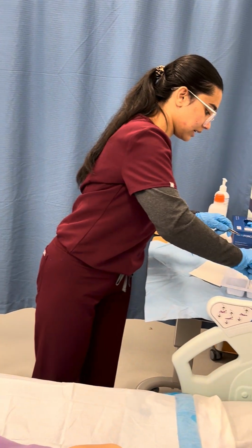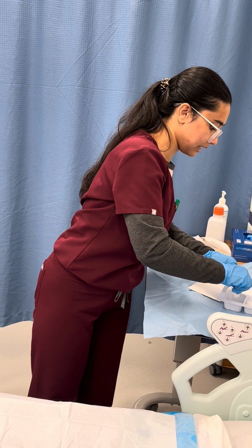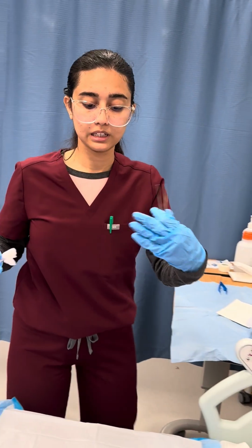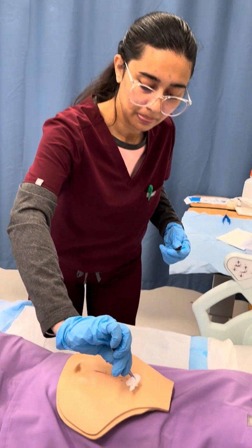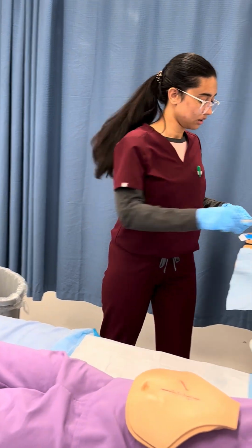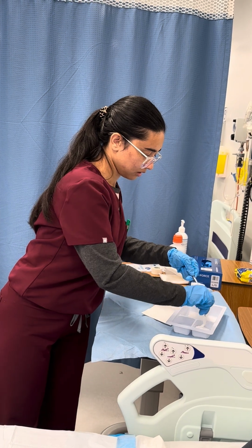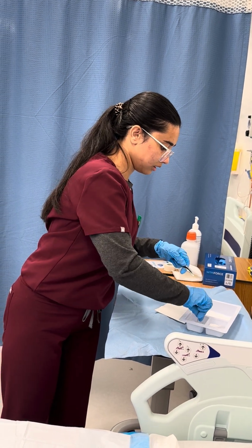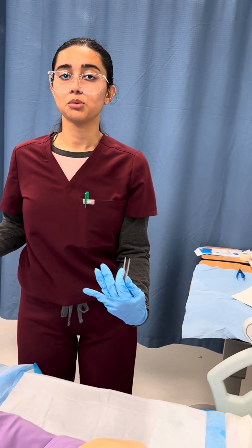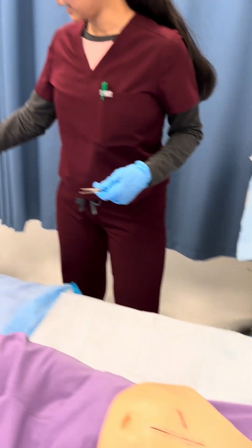I'm going to take another gauze piece, dipping it in normal saline and squeezing it. I'm going to clean the area that is away from me, head to toe in one stroke and discarding it. Then I'm going to take another gauze piece, dipping it in normal saline, squeezing it, and then I'm going to clean the area that is proximal to me or near or towards me in one stroke, head to toe, and discarding it.